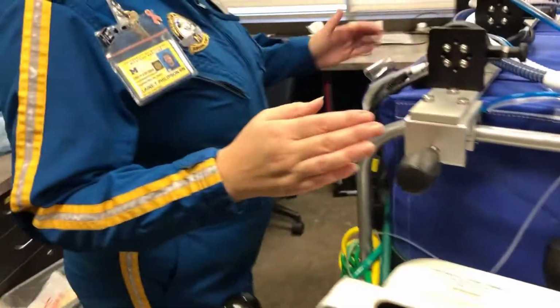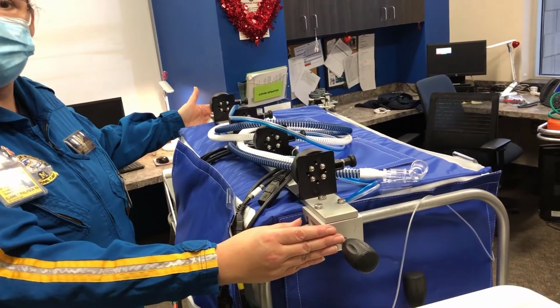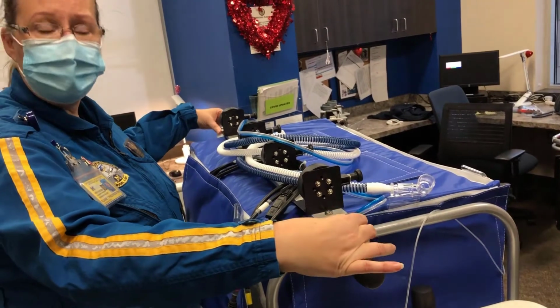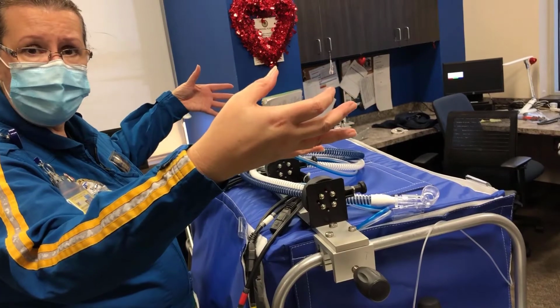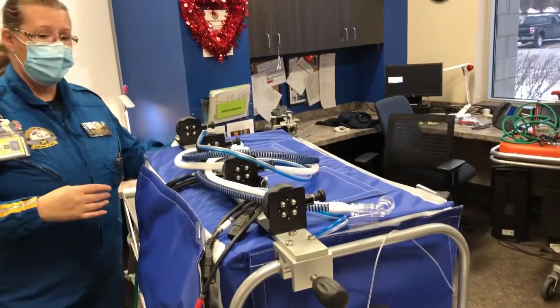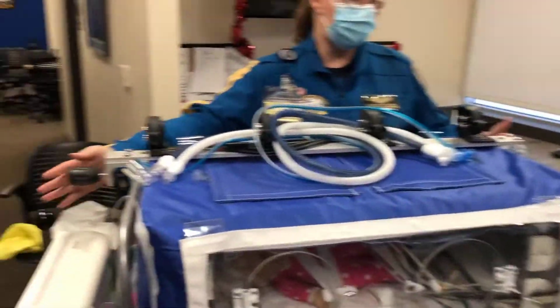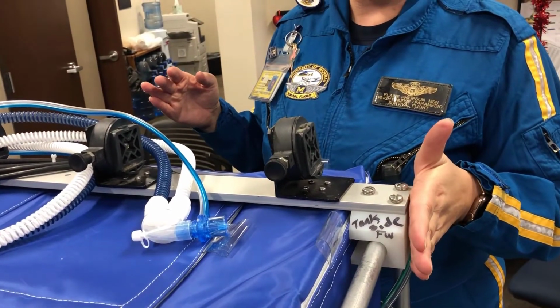The next thing we're going to do is we're going to need to install syringe pumps. We cannot use the brackets for the syringe pumps because those brackets will be used for the ventilators. So this is the bar that is on the LCB rotor wing Isolette. You're going to just take the entire bar with syringe pumps on it and install it. It is labeled with which end goes where. You want the handle to be over the Knox box so that nothing interferes with the jet ventilator on this end.